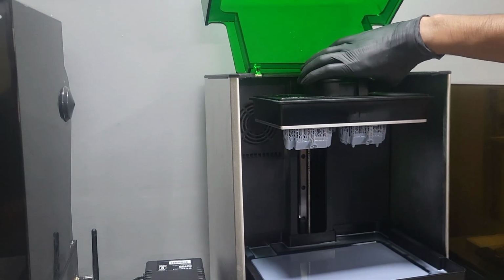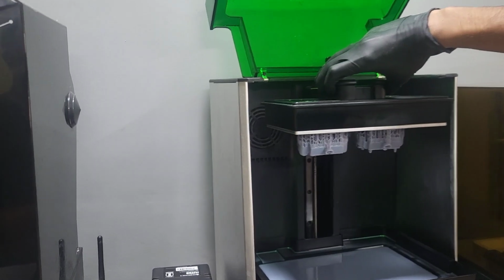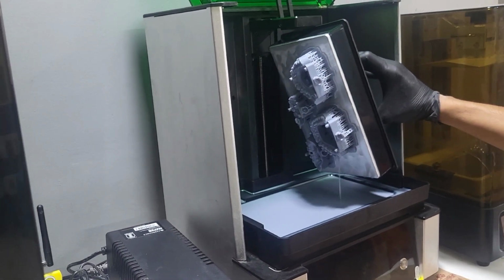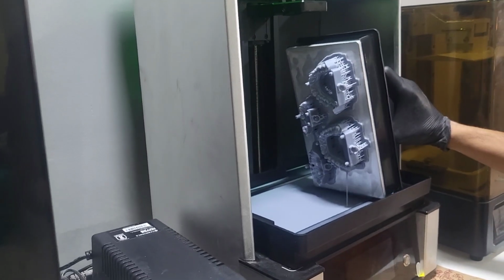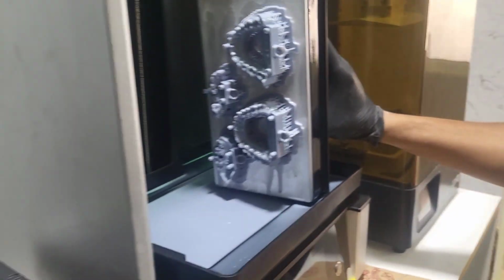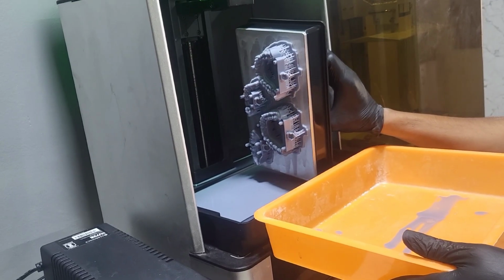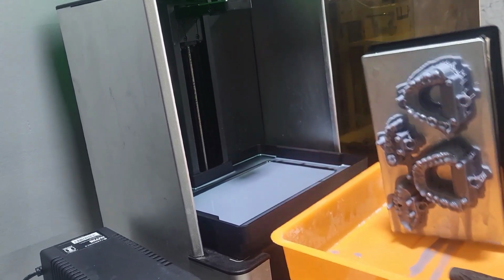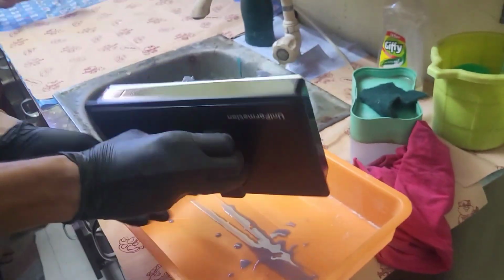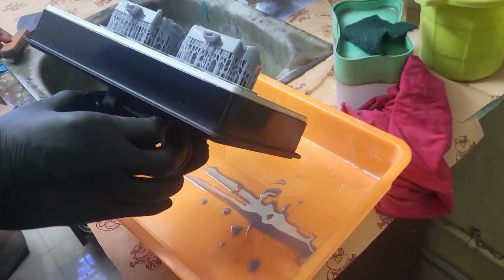And you can see the doctor is removing the platform from the printing machine, and you can see the models are still wet. You need to dry them for a few minutes as I showed earlier. We need to place them into the plastic tray, wait a few minutes for drying, and then carry on to the next step, removing the printed models from the platform.